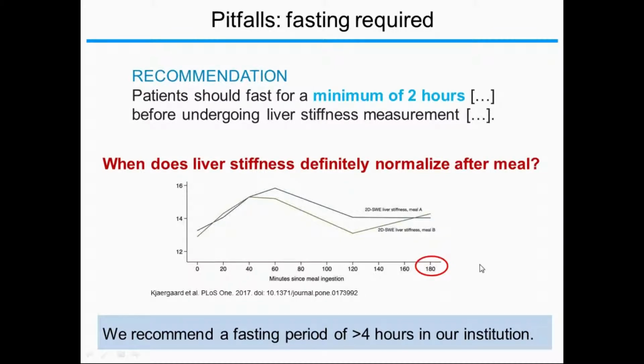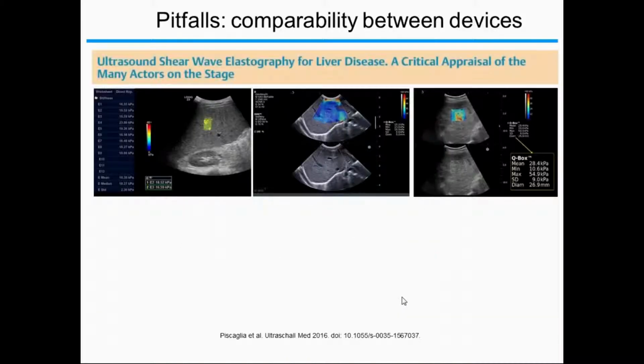However, there is still some uncertainty about when the liver stiffness definitely normalizes, and there is a recent work which followed up patients for 3 hours, and they still observed an increased liver stiffness after meal ingestion. So at our institution, we normally require a fasting period of 4 hours, and I recommend even overnight fasting in special situations like clinical studies.